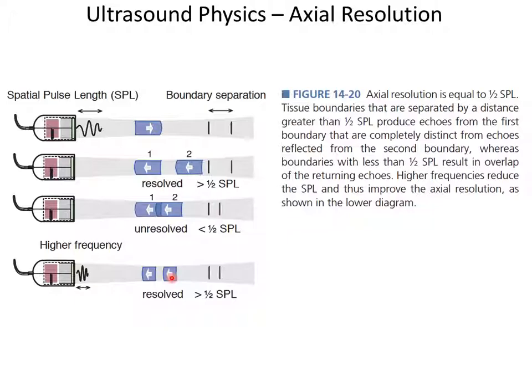However, if you just look at the amplitude of, say, 2 Gaussians, Gaussian 1 and Gaussian 2, and you put them together such that they're at 1/2, it basically makes one amplitude. That's indistinct. It doesn't have two peaks anymore. So that's roughly why it's there. But if you did some kind of interesting phasing of the signal, you could probably get away with more like that.